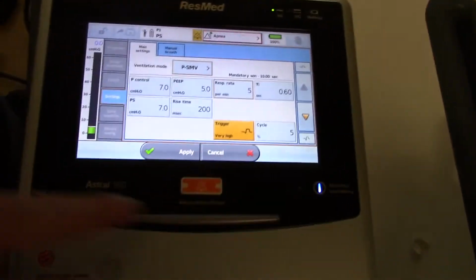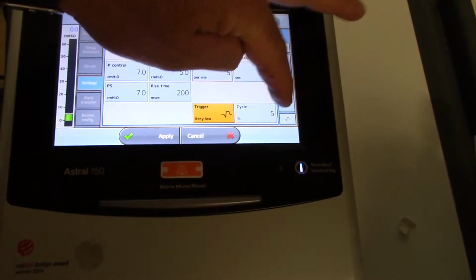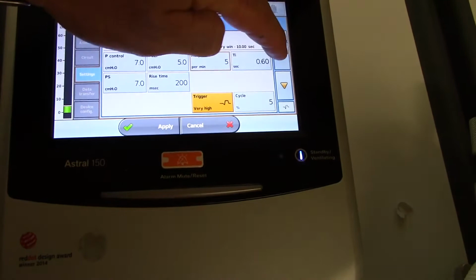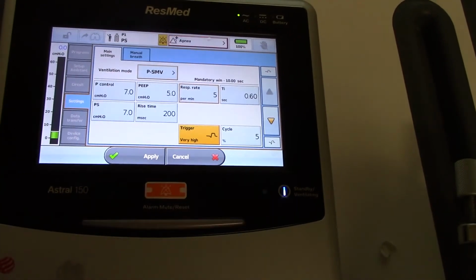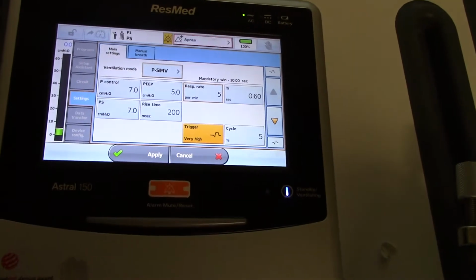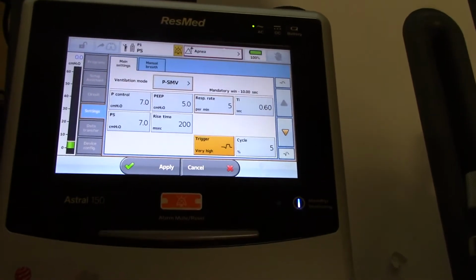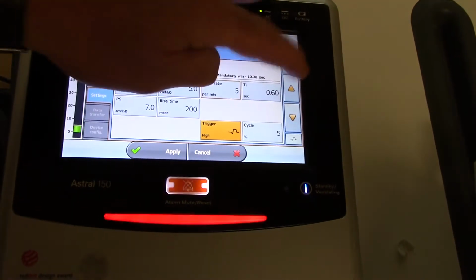The trigger: very high is most sensitive, very low is least sensitive. So if they're not cycling the vent or not triggering the vent well with their effort, you're going to put it on very high, right? Very high. And if they're auto cycling or it's picking up a hyperdynamic pulse, then you would adjust this down.